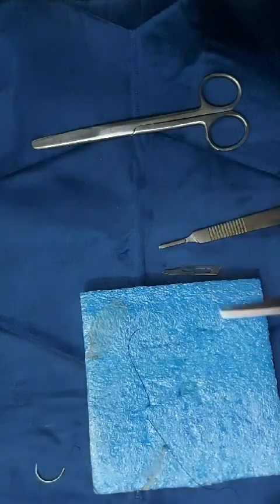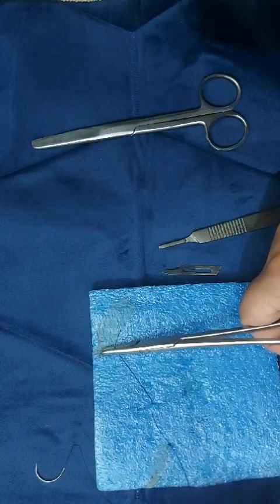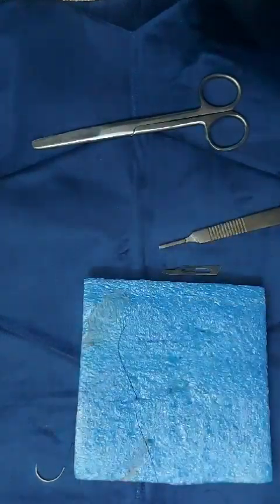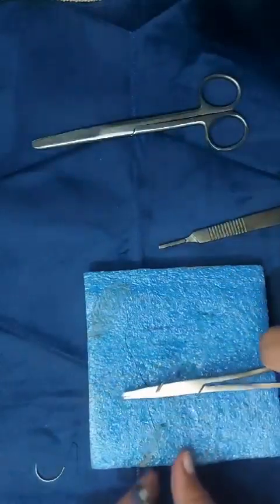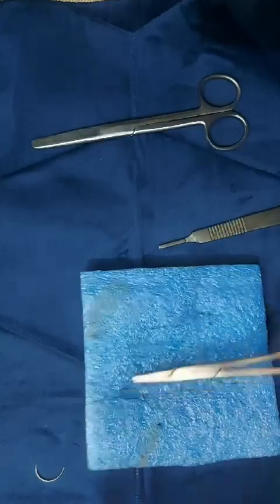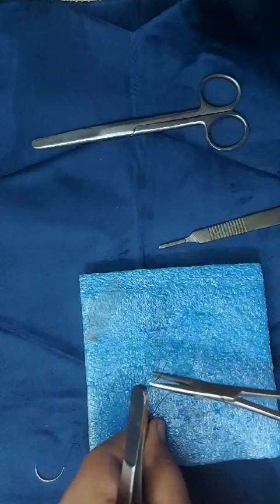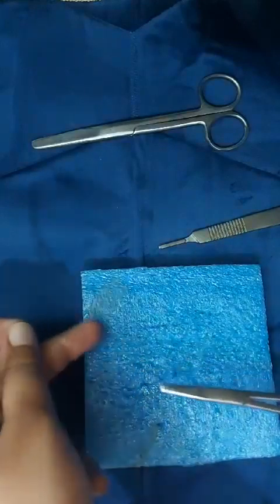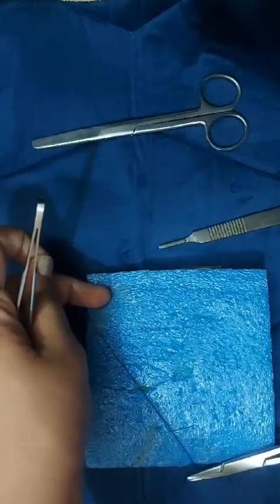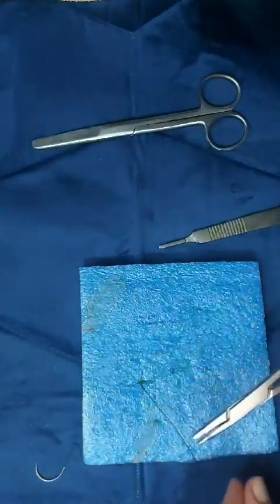Then I'm going to release it, leaving a short tail at the end of the suture. Now keep it in the center and then wrap it twice like this and stabilize it, and then make a knot like this. Just stabilize it and then go in the opposite direction.